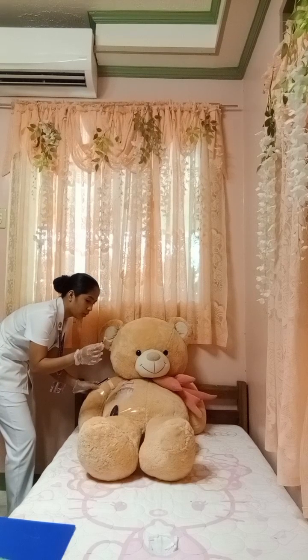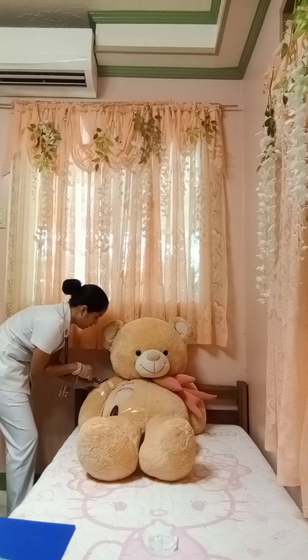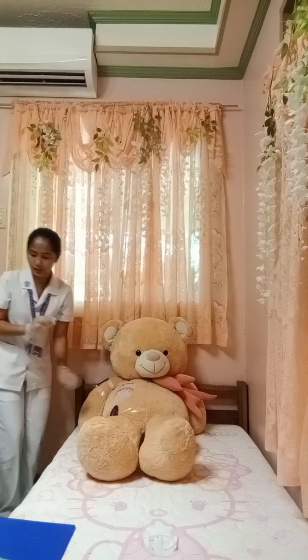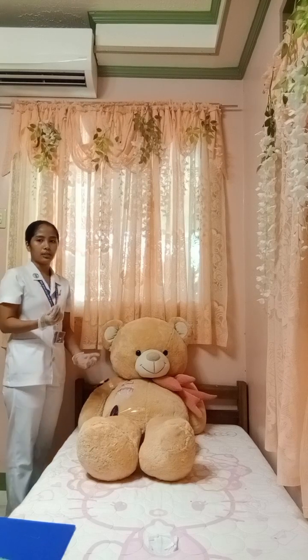Then hold the syringe with the thumb and the four fingers and insert the needle at a 90-degree angle. Then hold the barrel with the non-dominant hand and the other will aspirate. Then continue to inject the medication slowly. Then withdraw the needle at the same angle of insertion. Then apply a cotton ball and gently add pressure. Then discard the needle into the sharps container.